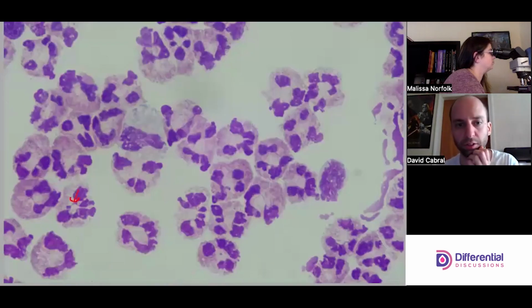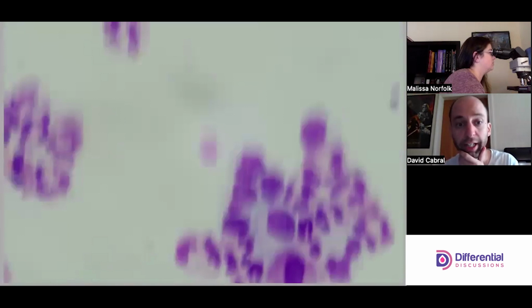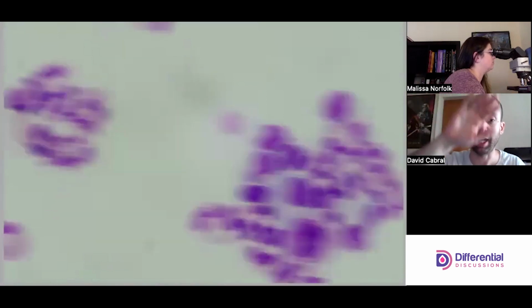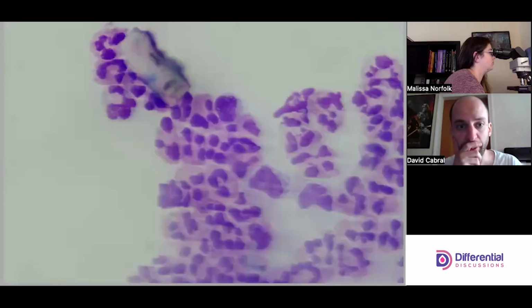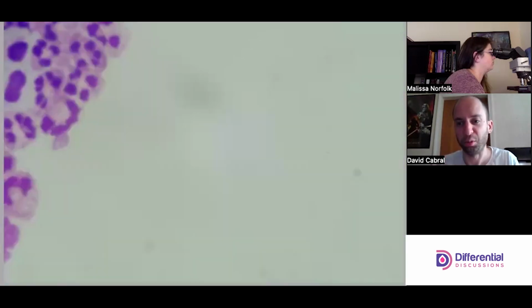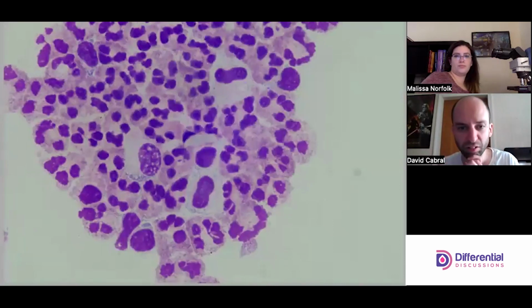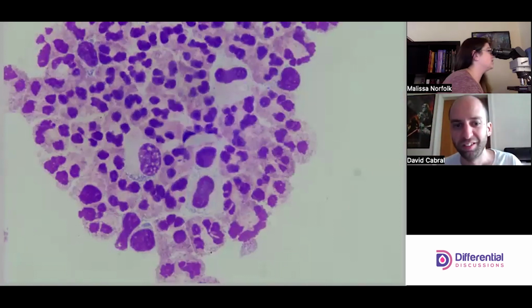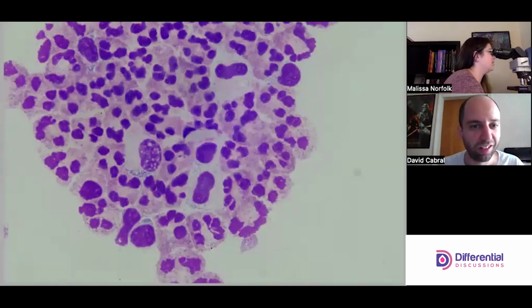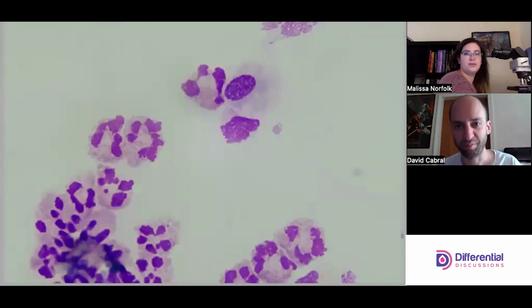Let me just go out to the edge too. We can see that as you get to the outside of the ring, we get a different presentation. The cells look a little bit larger. They get a little space to spread out. They get spready, and they may even smudge. Yep, they are smudgy.